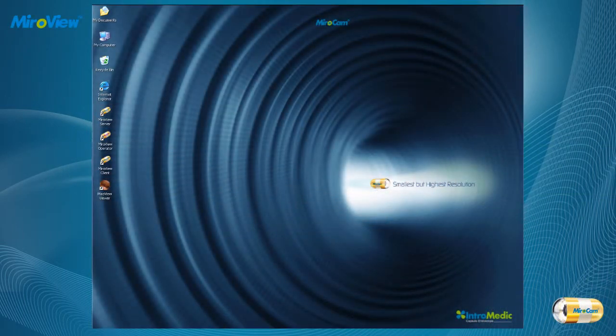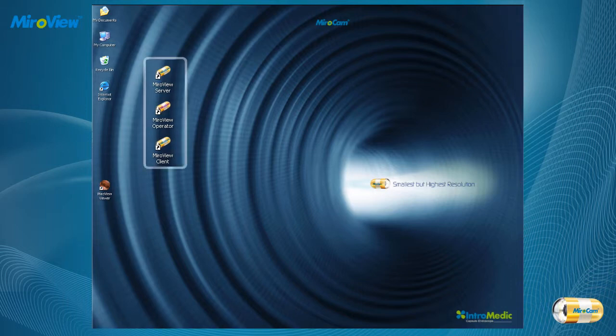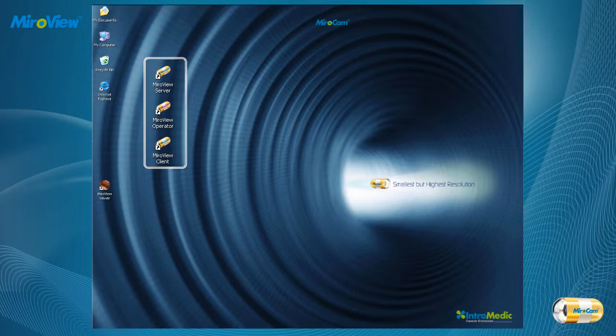This is an introduction to MiroView 2.0 software. MiroView 2.0 software is divided into three parts: MiroView Server, MiroView Operator, and MiroView Client.